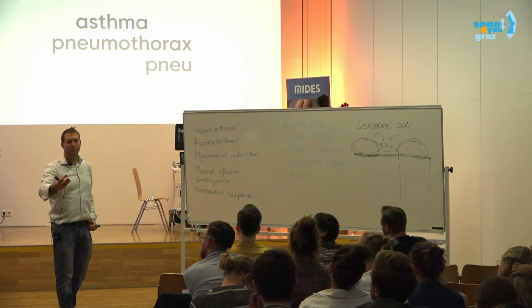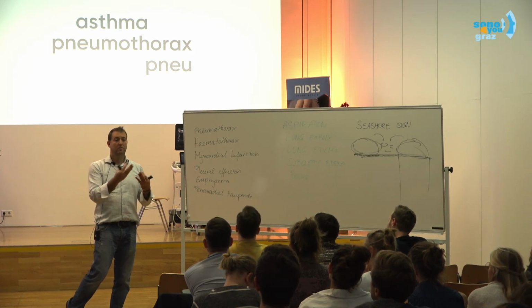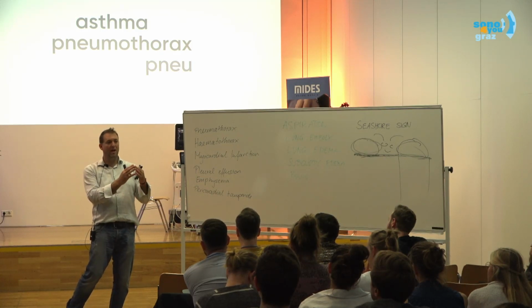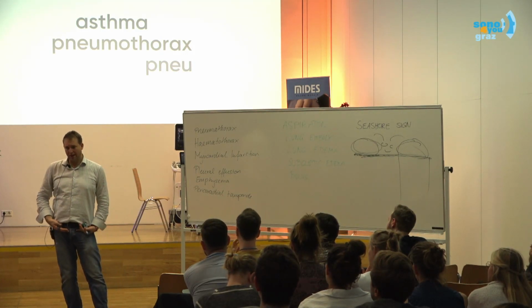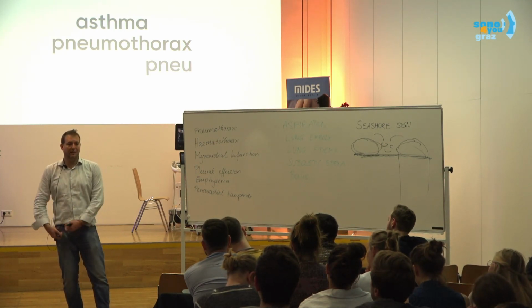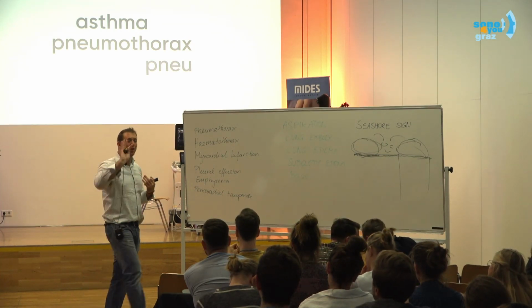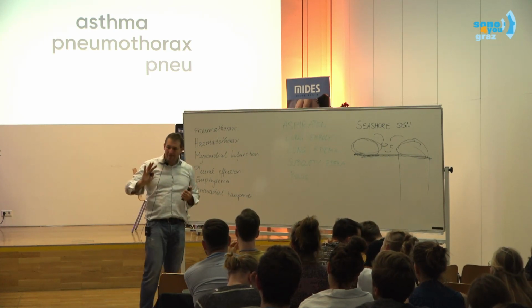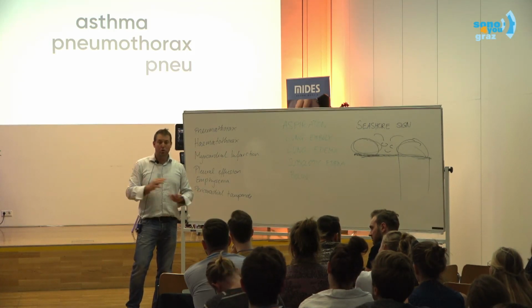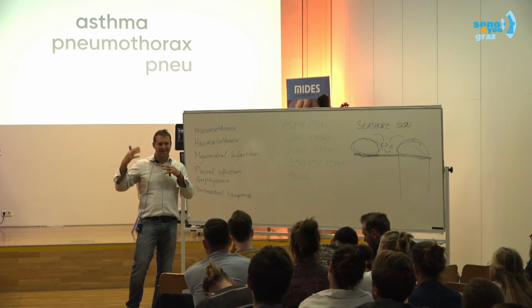But how will we know? Sonographically, how can we identify massive pulmonary embolism? With heart ultrasound, yeah? We will have acute cor pulmonale, and don't forget the DVT, deep venous thrombosis. We can identify the thrombosis that went up and became an embolus. Make sense? So remember, pulmonary embolism is a tricky disease because auscultation-wise, lungs are okay. Sonographically, lungs are okay. Because this is not a lung problem. It's a circulatory problem.